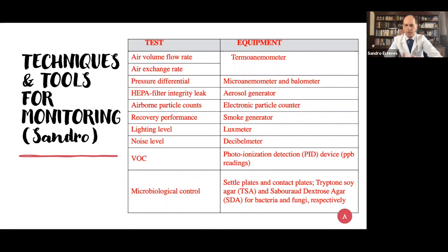We are not only taking measurements, let's say, in the morning and in the evening. It's continuously on. Our threshold is 100 parts per billion, and if it is above that point, we don't do critical activities. So if we have to open an incubator, we won't do that.